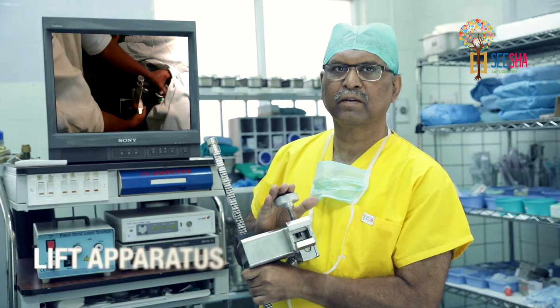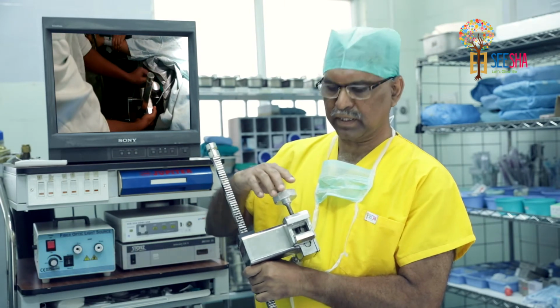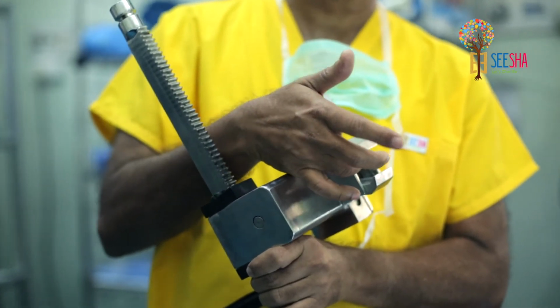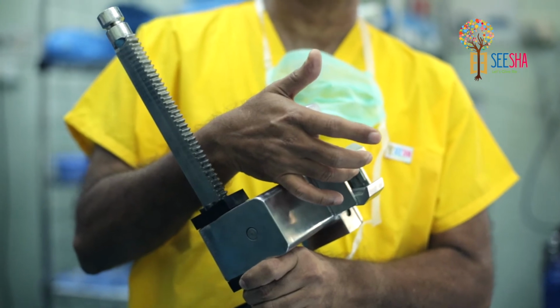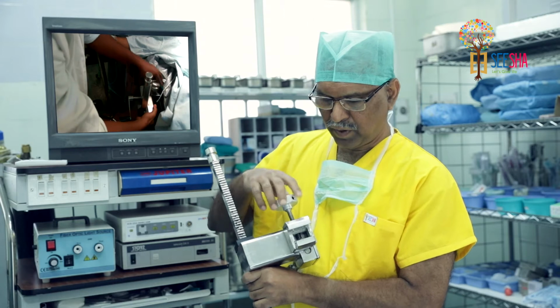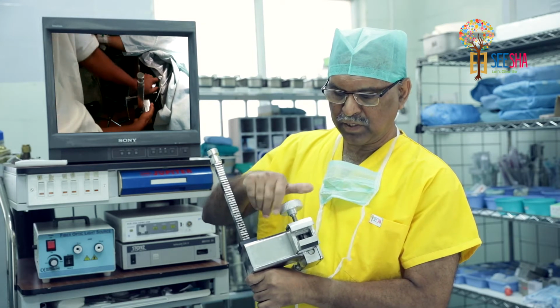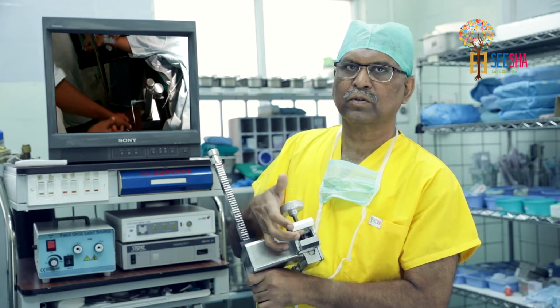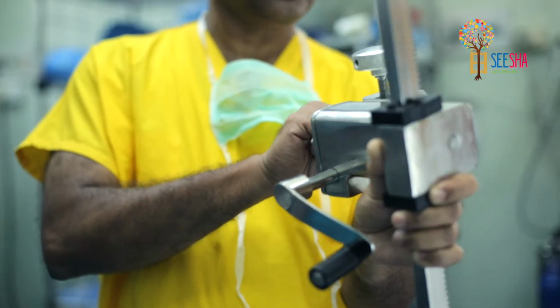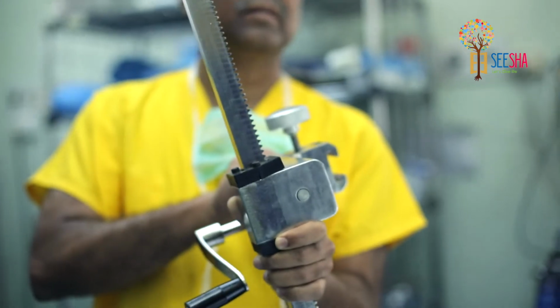This is part of the lift apparatus that we use for diagnostic laparoscopies. The advantage is that each place has a different type of operating table, and it's difficult to use the standardized lifts. So what we have done is to make an arrangement where the size could be altered so that it can fit into any of the operating tables. We also have a special V-shaped groove which makes it hold on to the table very tightly.